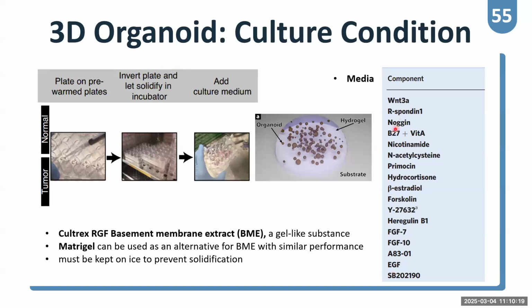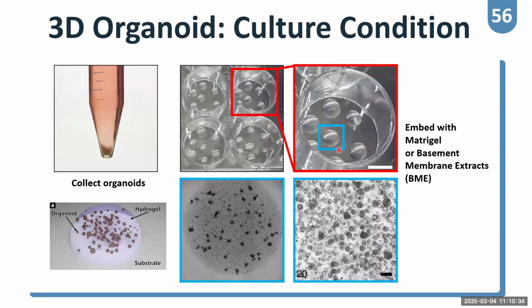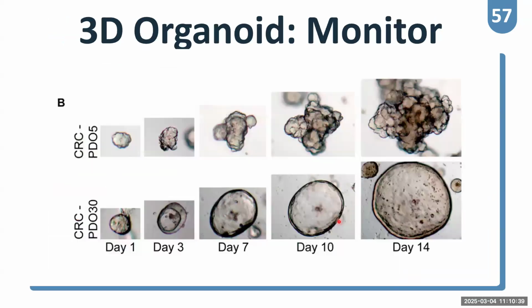You will see it's quite expensive to perform organoid experiments because they require a lot of components in the culture media. Okay, it's quite expensive to do organoids. And you see here, just one dome contains a lot of organoids.